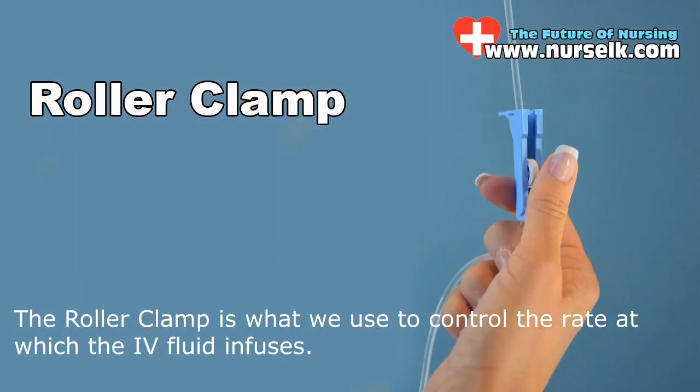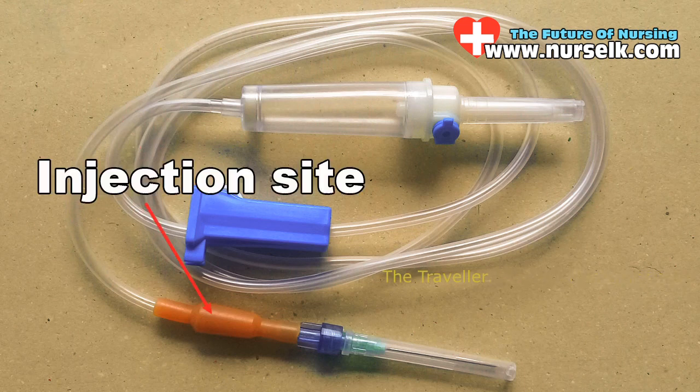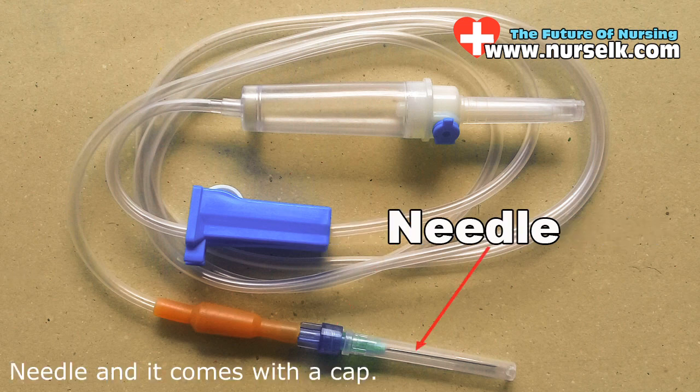Next is the tube, the injection site, the luer connector, and the needle, which comes with a cap.